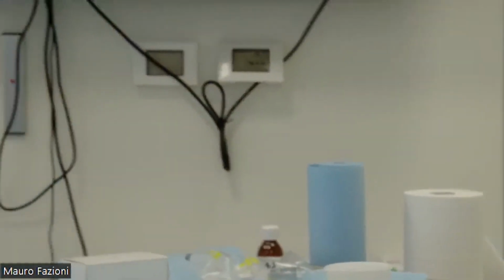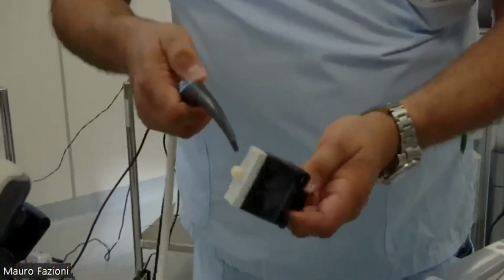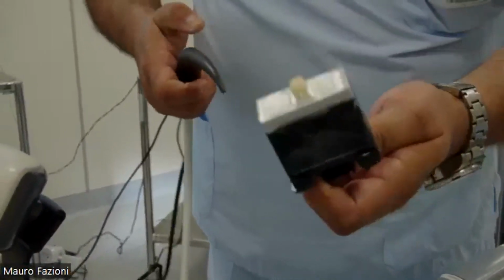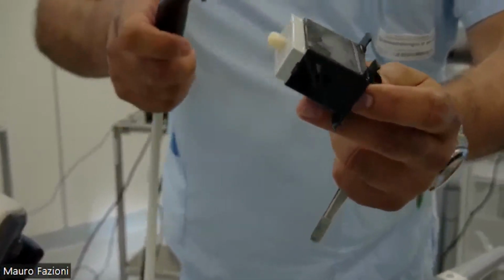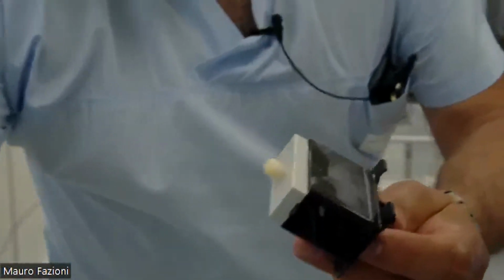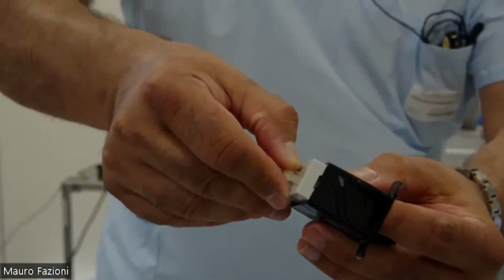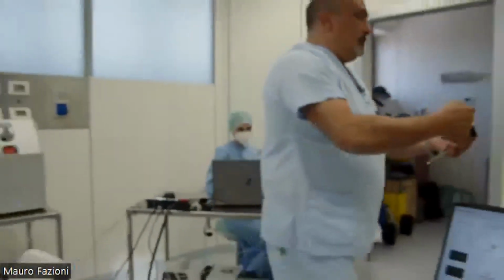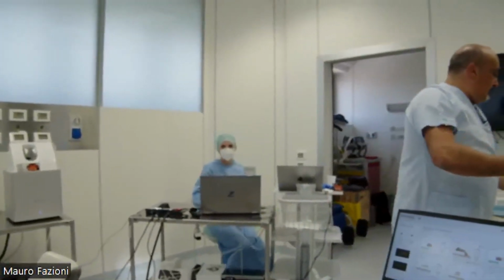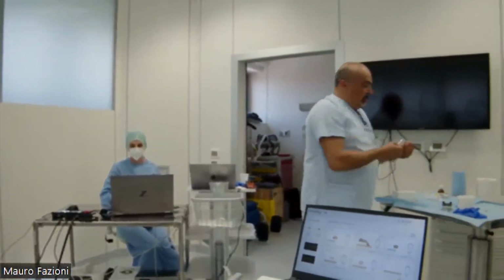Here you can see, and now we will cure the abutment. You can see the surface, okay. We can remove the tooth from the base, and we will perform the post-curing, okay.